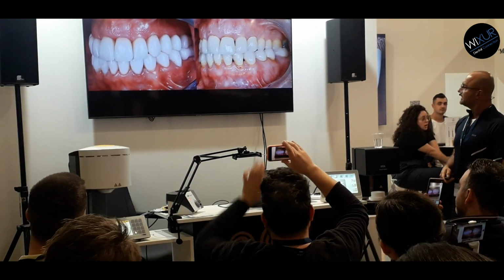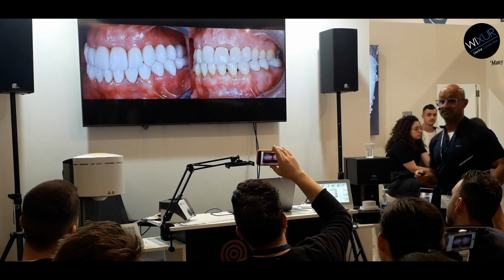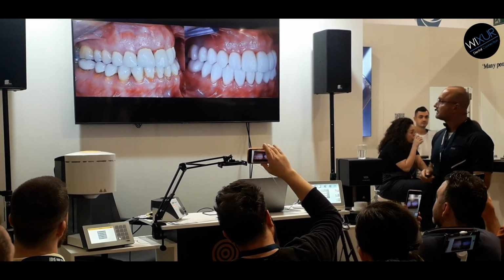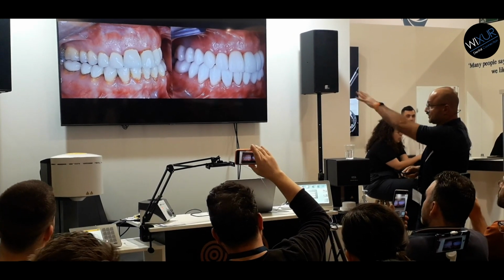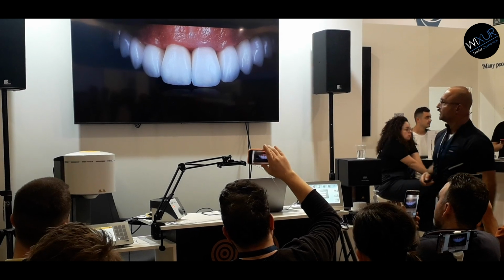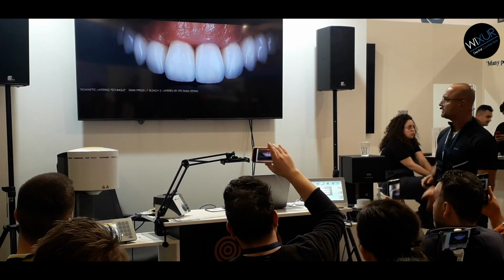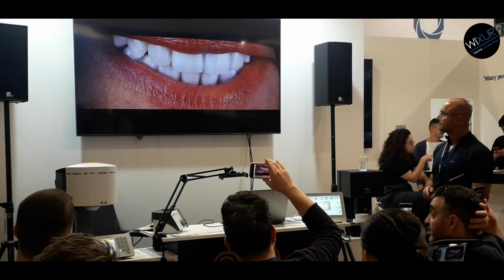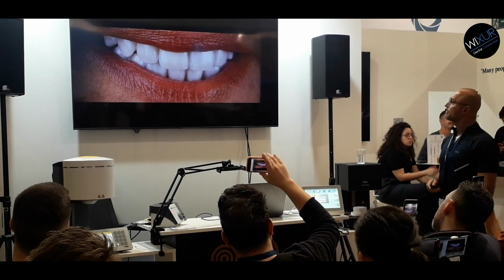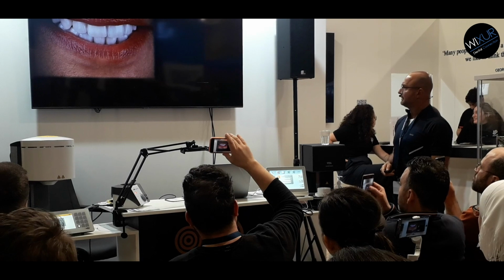So left side, the most critical part. So we have overjet, we have overbite, we have the function, we tested already. Right side was not very difficult. Intercuspal position is nice, everything is intact. The gingiva is beautiful, everything is healthy. Of course, we lost a lot of gingiva, but it was what it was. And the smile. And then you will see that the face changed. If everything is right, you make people happy.